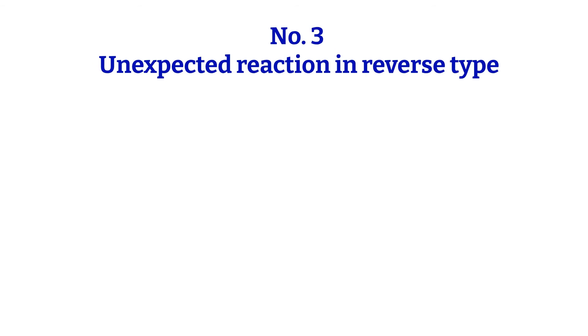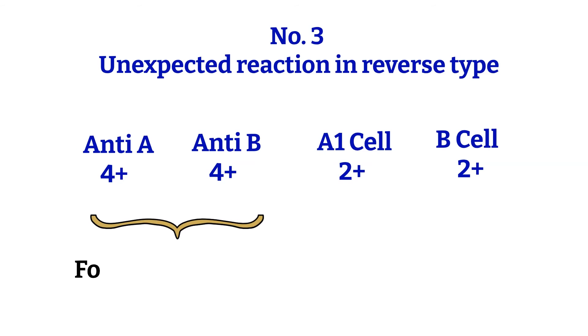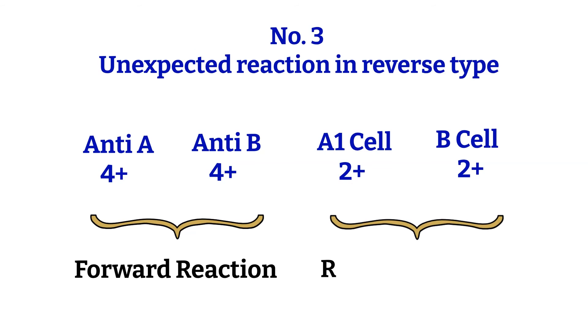Number 3: another example of unexpected reactions in the reverse blood type. Anti-A 4+, Anti-B 4+, A1 cells 2+, B cells 2+. What could cause this reactivity?